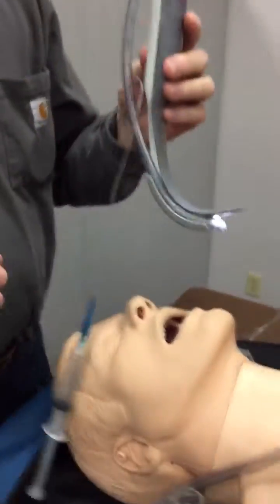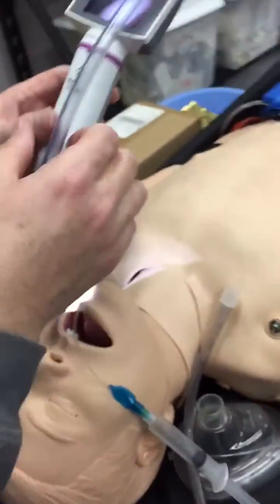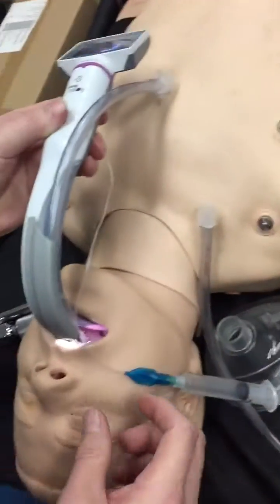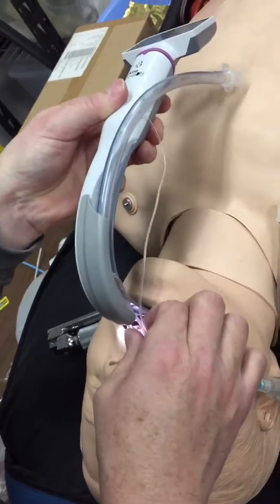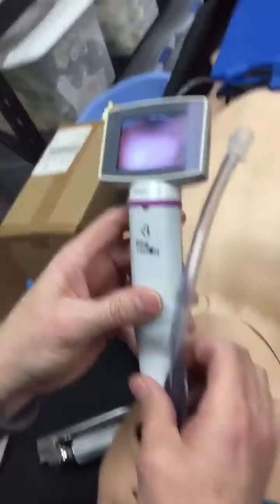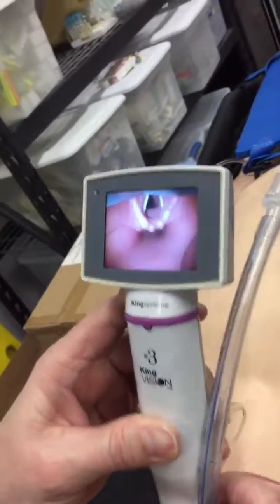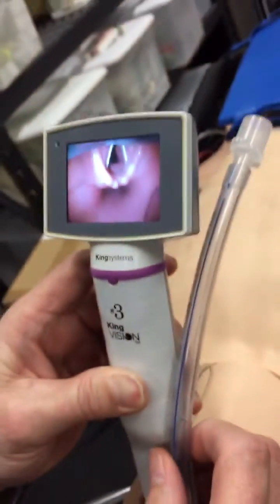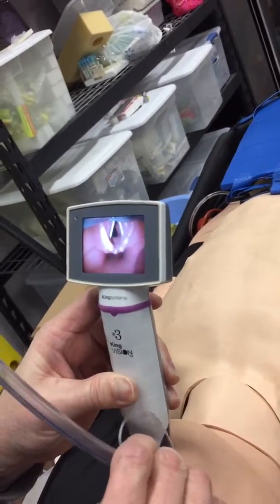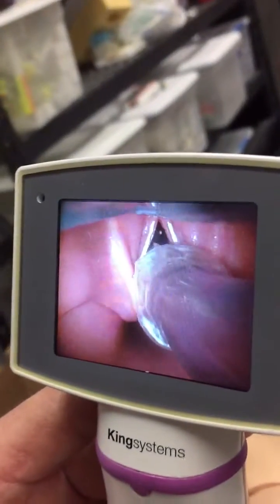We're going to demonstrate how well it works. We enter the oropharyngeal airway here and we can visualize the teeth and the tongue as we are going in. We will make our way down to the epiglottis, and right there is a really good view of our glottic opening.